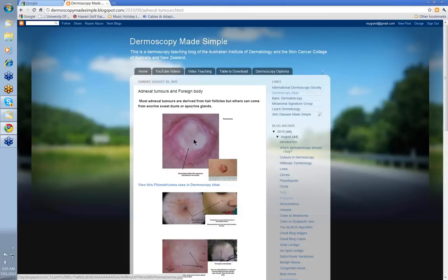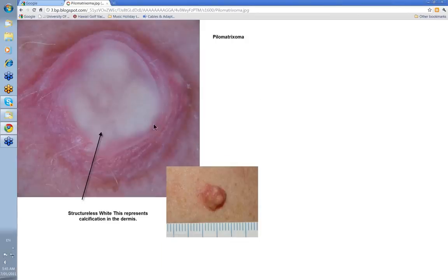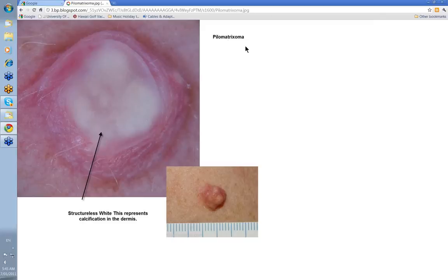Let's look at image one here — white structureless. In this circumstance, white structureless represents calcification in the dermis, and the tumour is a pilomatrixoma. This is a tumour you're generally going to see in young children rather than adults, and it will usually be in the cheek. It will feel very hard, like a hard epidermal cyst. When you put the dermatoscope on it, you generally see either white structureless like this, or you may see a mixture of blue and white structures.